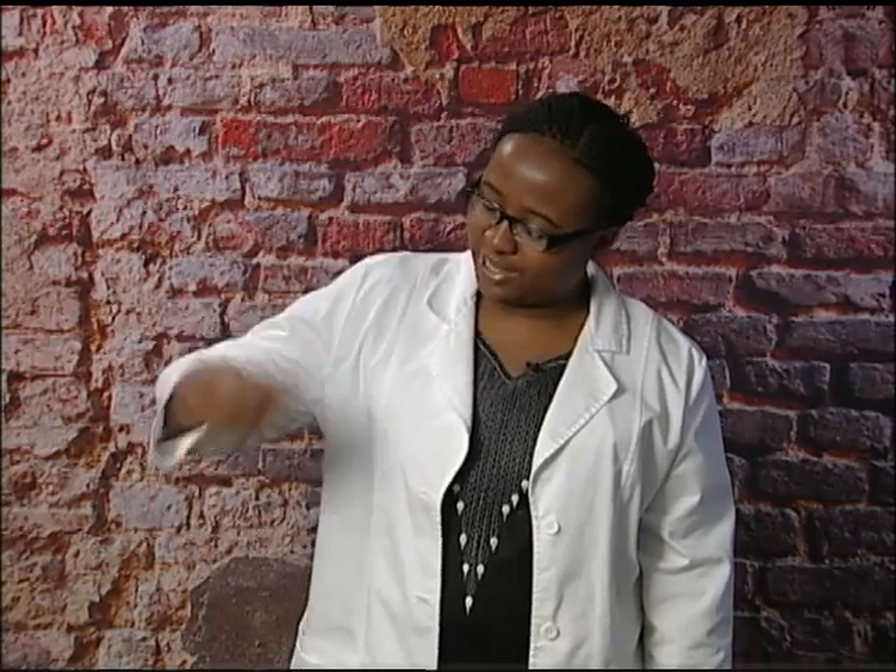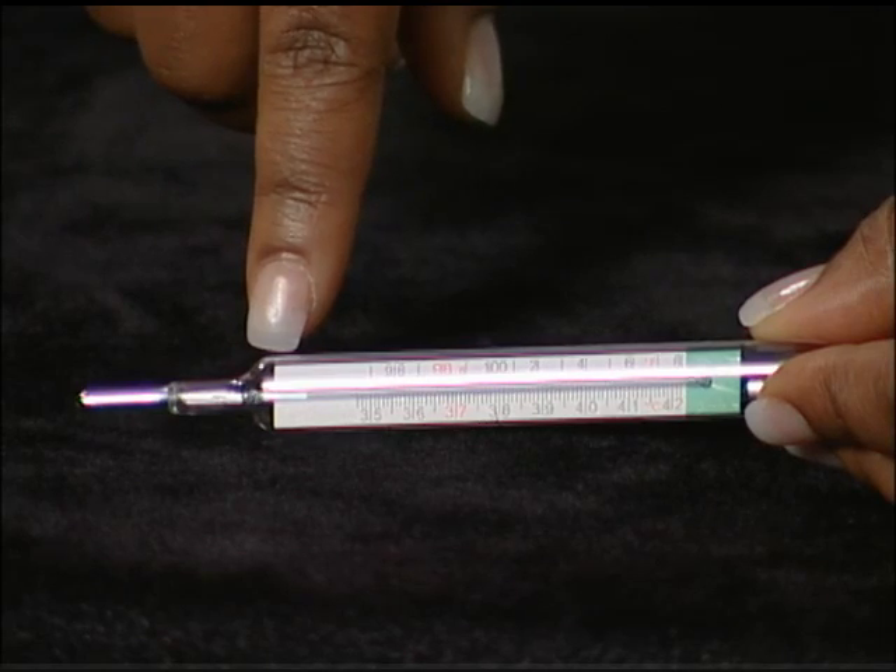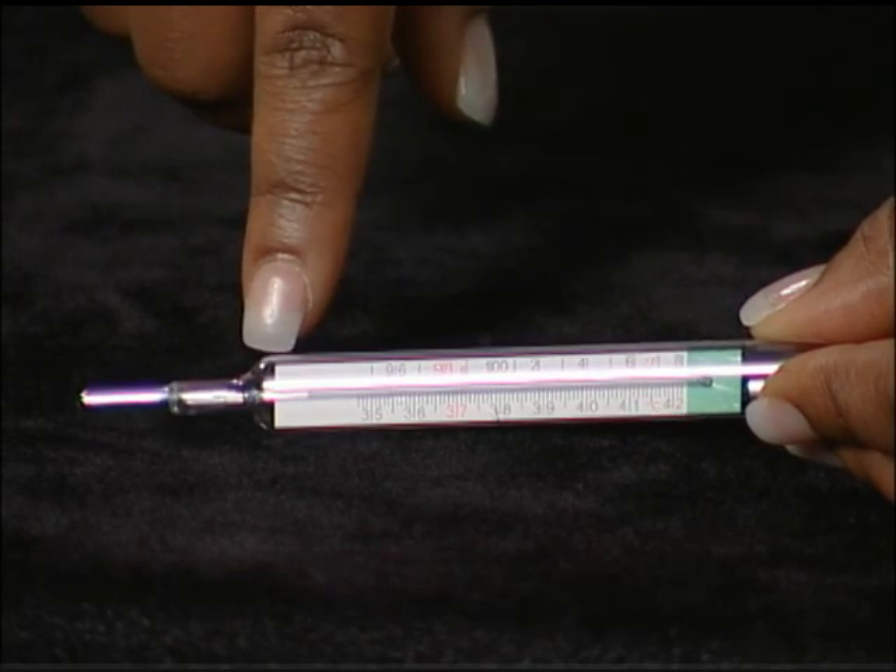If using a glass thermometer, first shake the thermometer. Use a sharp downward wrist motion to shake the thermometer until it goes way below where the number starts. Glass thermometers should be free of mercury, a potentially harmful chemical. And if your glass thermometer is cracked or broken, it must be thrown away.